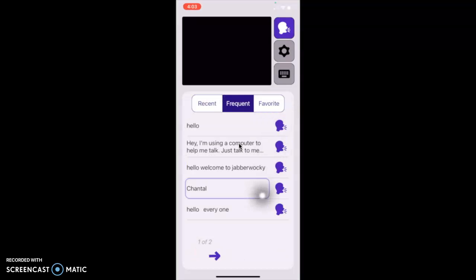Hey, I'm using a computer to help me talk. Just talk to me normally, but I need more time to answer. Is that all right?